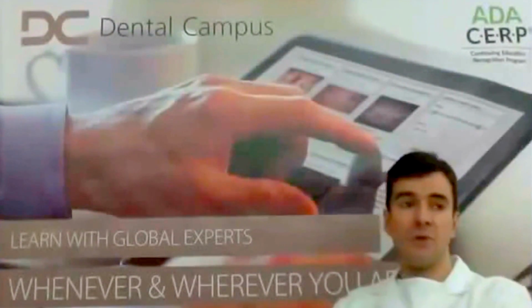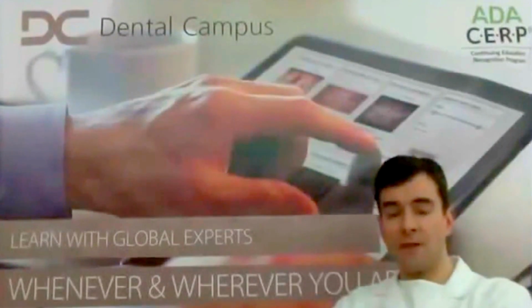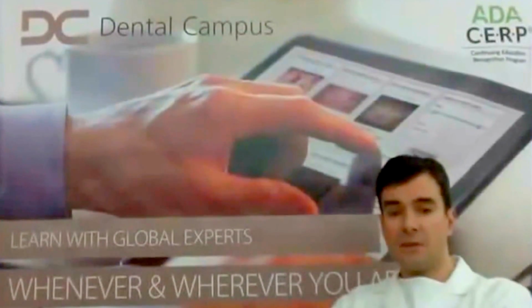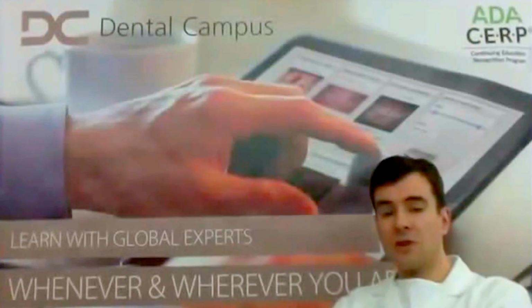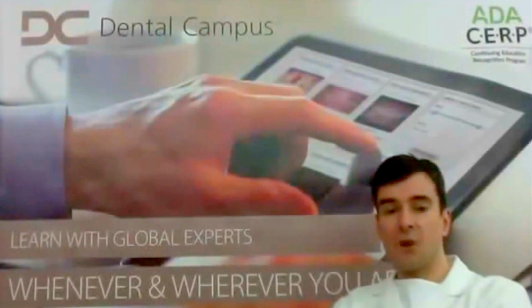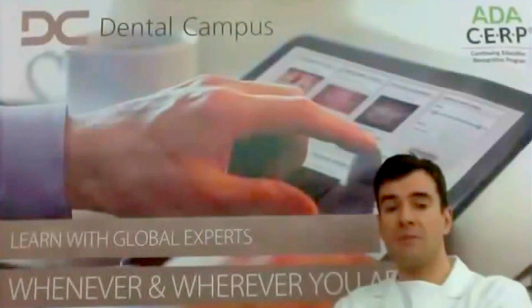And if we use, let's say, a bone level implant, then it's recommended to have at least 3 millimeters of distance to get the emergence profile, for aesthetic reasons, so again to generate the correct height of the crown. In the posterior region, in which the pink aesthetic is not so important, the traditional recommendation from the industry for bone level implants was to place a bone level implant epicrestally.